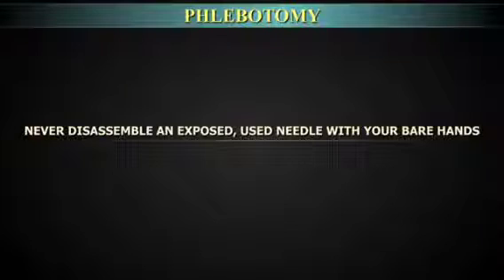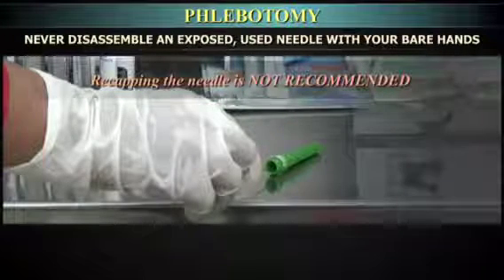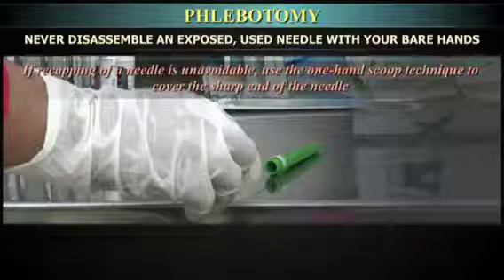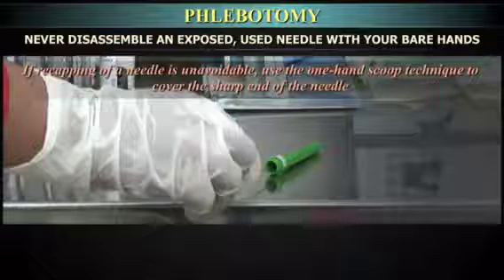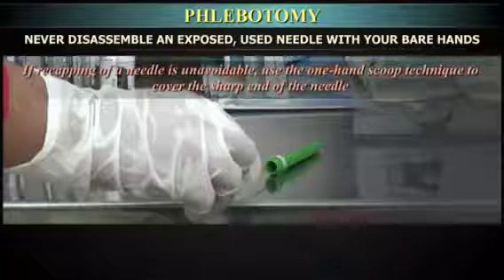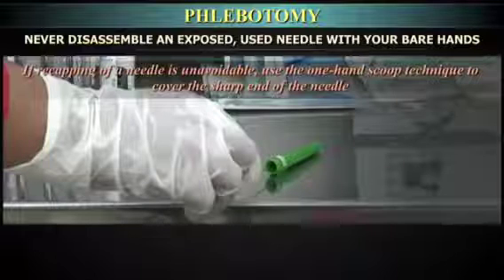Never disassemble an exposed used needle with your bare hands. Recapping of the needle is not recommended. If recapping of a needle is unavoidable, use the one-hand scoop technique to cover the sharp end of the needle and thus to safely remove the needle from the holder.